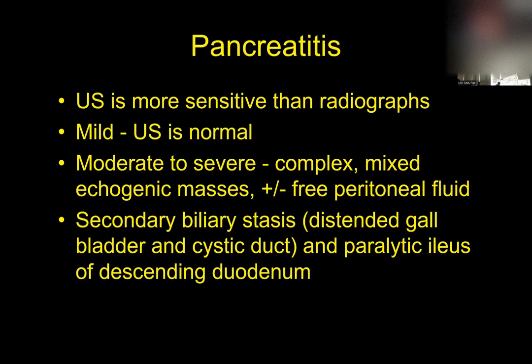Radiographs for looking at pancreatitis are pretty insensitive, if you remember. Next to the stomach and the duodenum is where the pancreas lives, and so sometimes the duodenum, like we talked about, that sentinel loop, becomes mildly gas-filled secondary to pancreatitis, but there's nothing radiographically specific for pancreatitis. Sonography is different. On ultrasound, typically, if they get pancreatitis, we're going to see some abnormalities in the region of the pancreas.